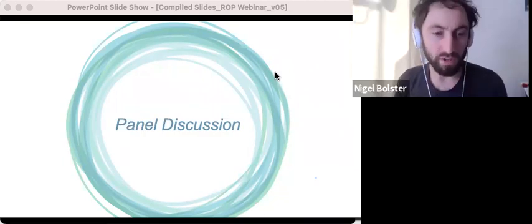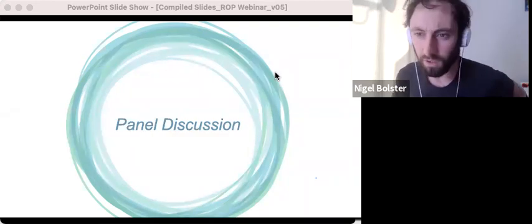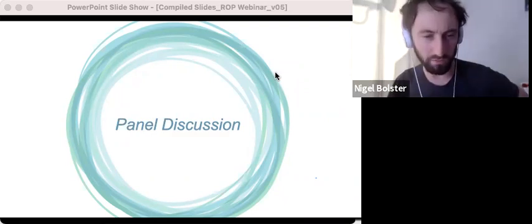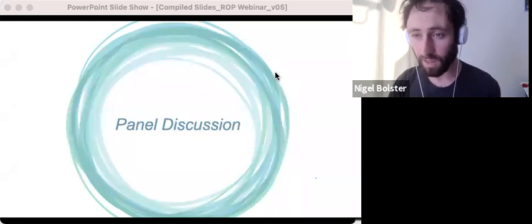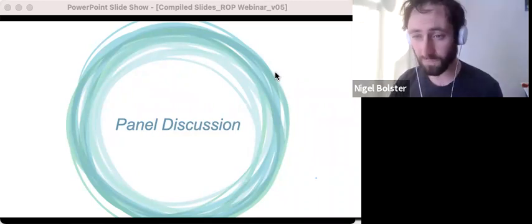Yeah, thanks, Aisha. Based on testing that we've done on a Model I, which is a known quantity, we approximated it's a 52-degree subtended angle in a single image, and then you can pan around the eye to see more. On the connection, it's connected via USB to either a laptop or a tablet, and that's where it draws power from. So it doesn't need to be connected to mains, and it doesn't have an internal battery itself. And also that's where it streams images and video to.